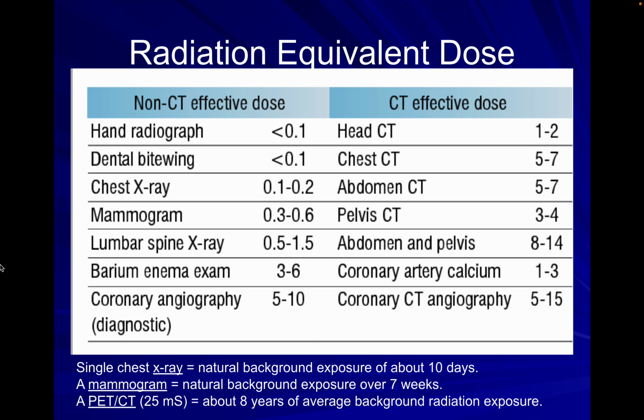And so just so you have an idea of the relative degree of radiation that some of these studies might have if your patients are particularly worried about the risks and benefits of exposure to radiation, to gather some diagnostic data.